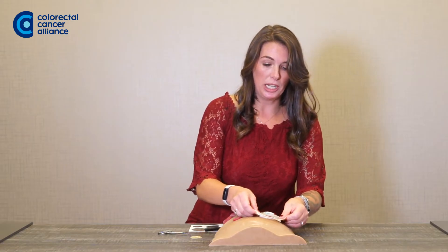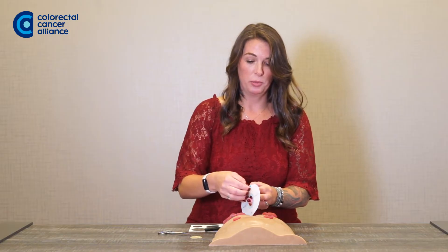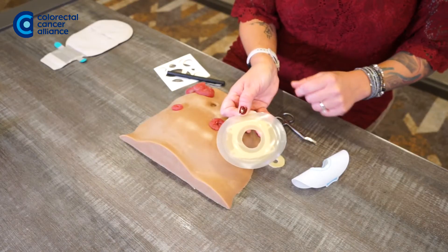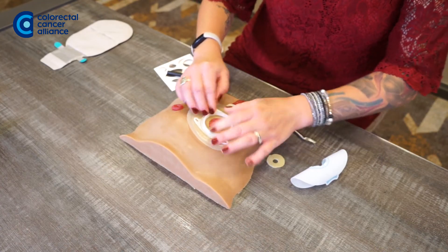Do one more double check to make sure that it's a good fit. Once it is, you want to remove the adhesive. If you're using any accessories like paste, barrier rings, or anything like that, this is the time you're going to want to put them on the wafer. Once you've done that, you can go ahead and apply.